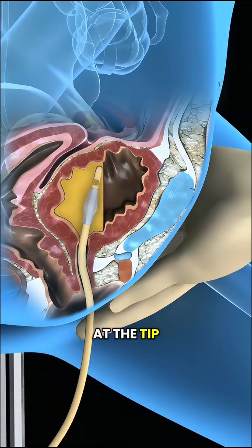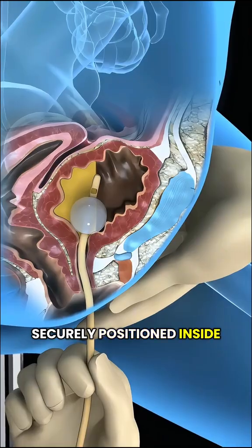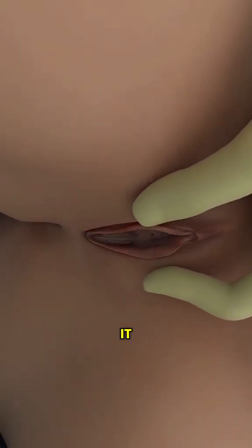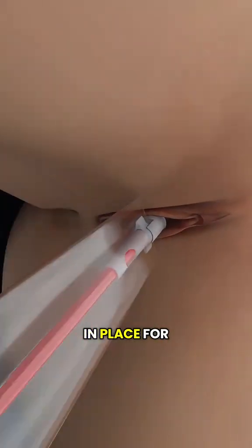Once in place, a small balloon at the tip of the catheter is inflated to keep it securely positioned inside the bladder. The other end of the catheter is connected to a drainage bag that collects the urine. The catheter allows urine to drain continuously and can stay in place for as long as needed.